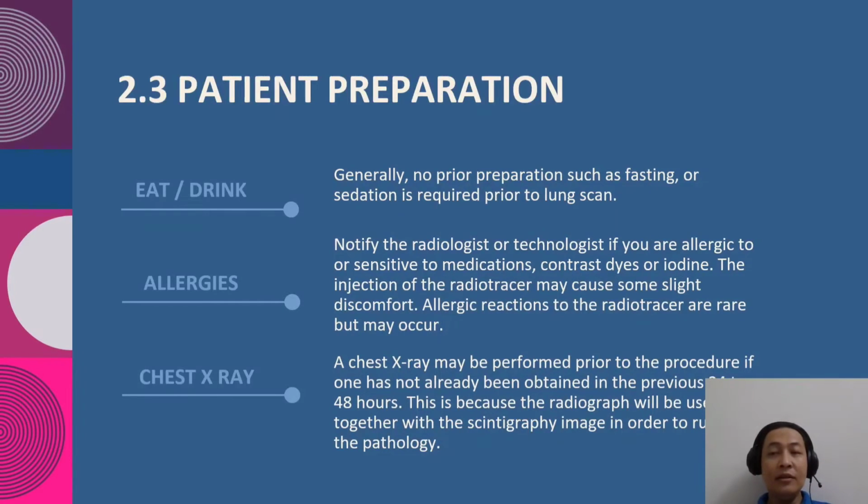Then a chest X-ray may be performed prior to the procedure if one has not already been obtained in the previous 24 to 48 hours. This is because the radiograph will be used together with the scintigraphy image in order to rule out pathology.